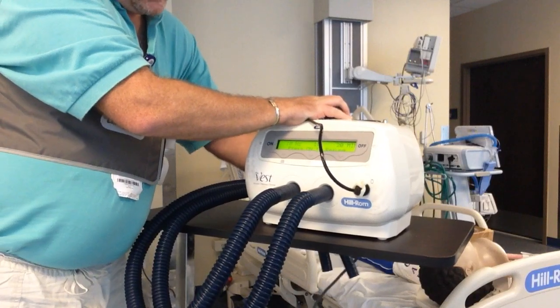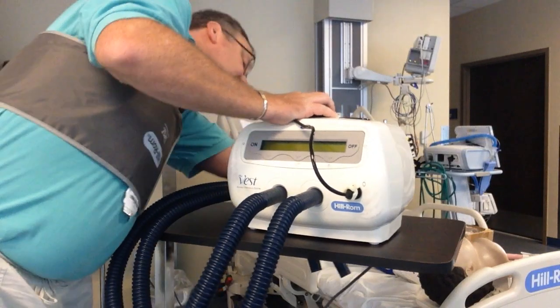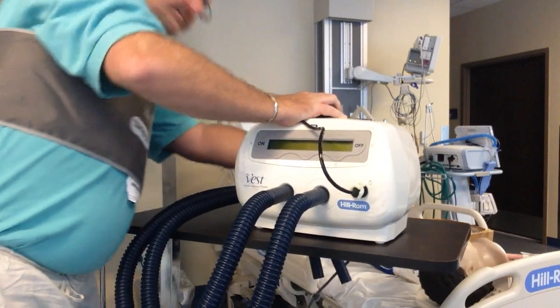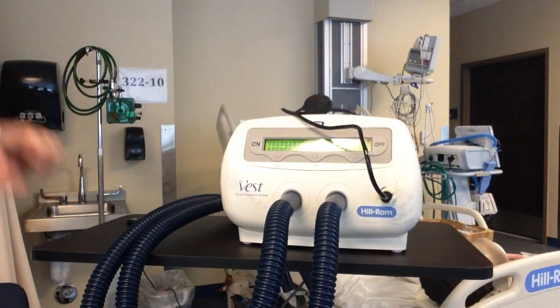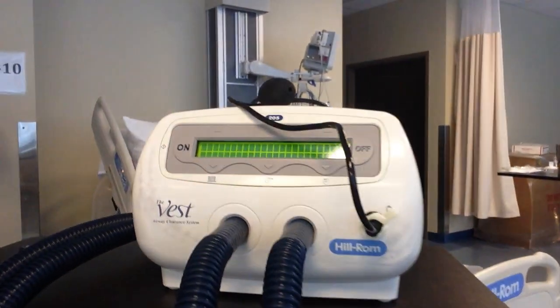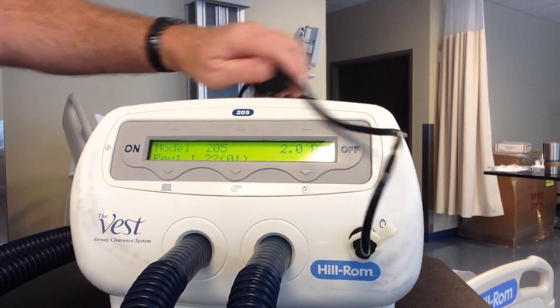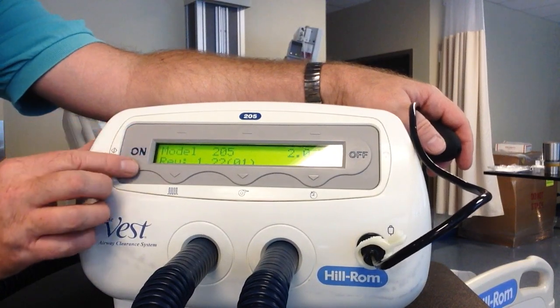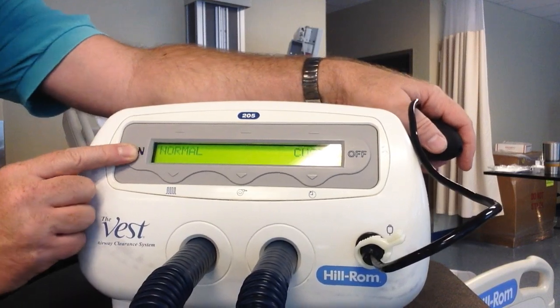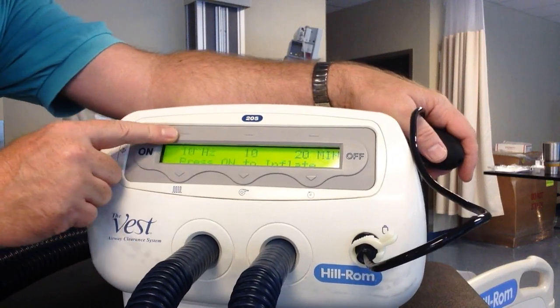When you first plug it up, it will go through its own self-test. Now I will get the glare off of it. So it did its own self-test, and then you can click on. It'll ask you if you want a custom treatment or a normal treatment. We're just going to go with normal.